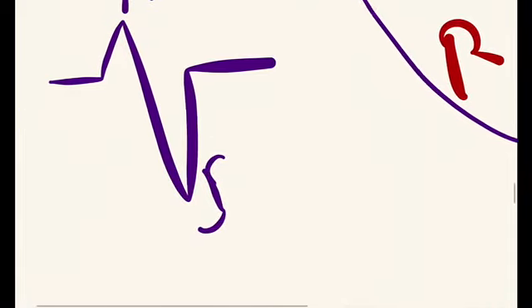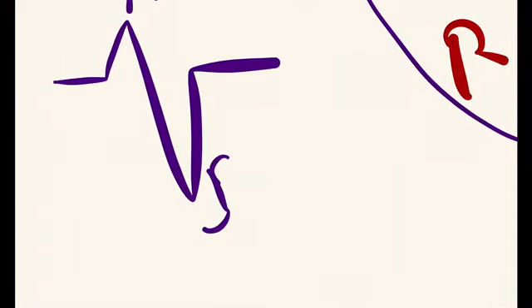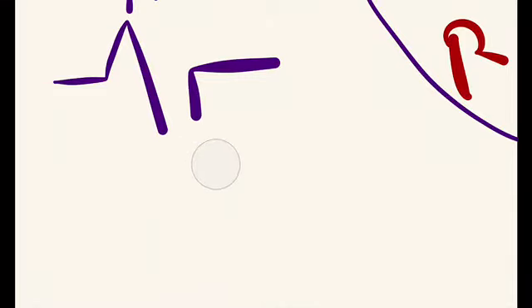This S wave was influenced more by the left ventricle, as we have talked about multiple times, because the left ventricle has more muscle mass. Because of the infarction there will be less influence of the left ventricle on the ECG, so the peak of the S wave will be less in lead V1.